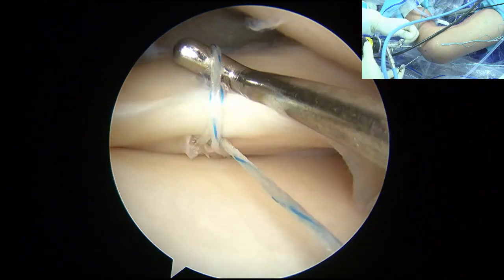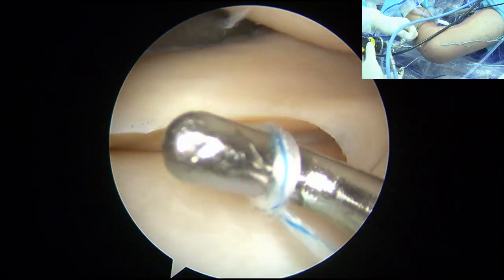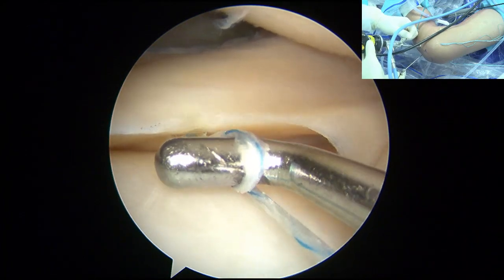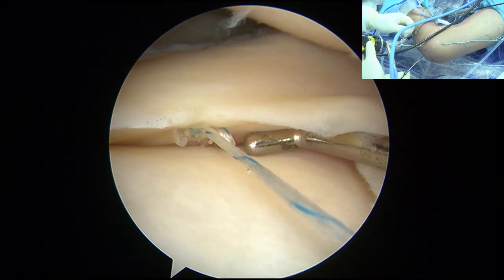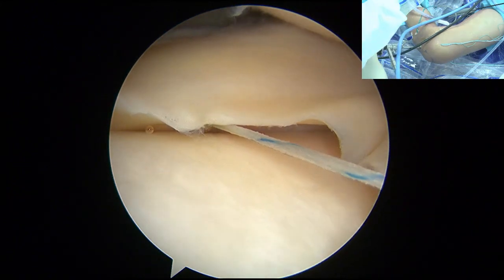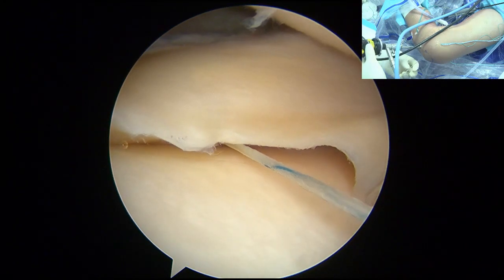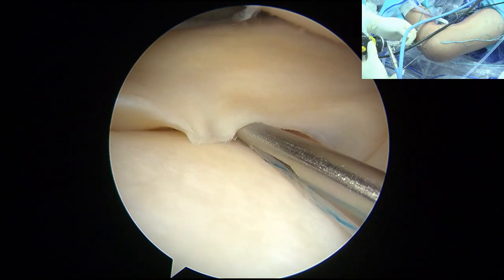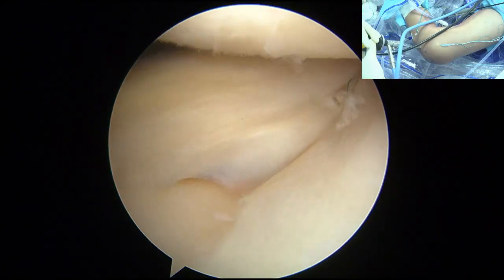See? Otherwise, sometimes you pull too strong and your anchor will get out. So this is a trick to make both sutures in equal tension, and it's safe for your anchors also, right? And then you satisfy, then you push that. Okay? Here? Good. So now you cross the undersurface. Good. Like that, okay? Good. 现场老师有提问吗? Yeah, cut it, okay? Another one.